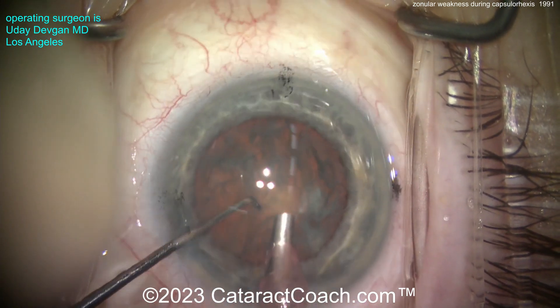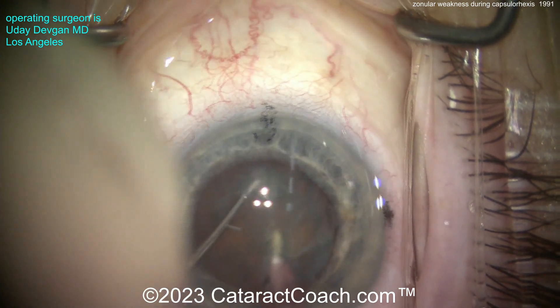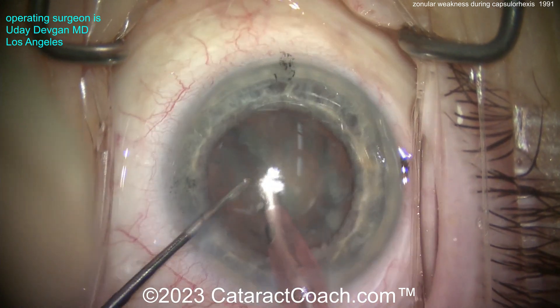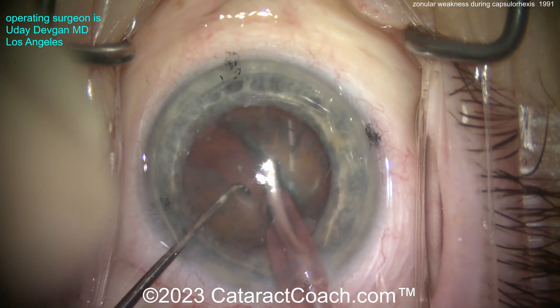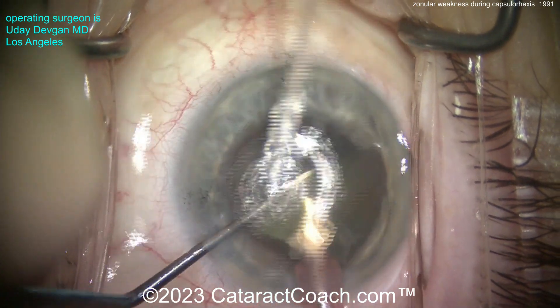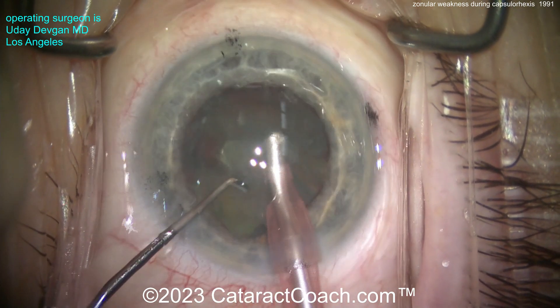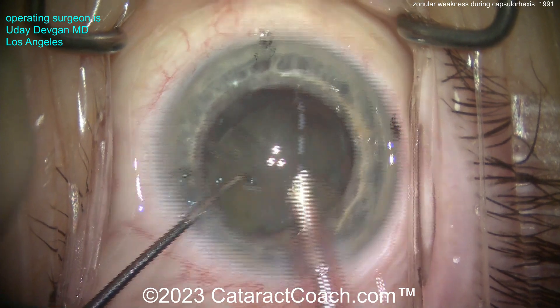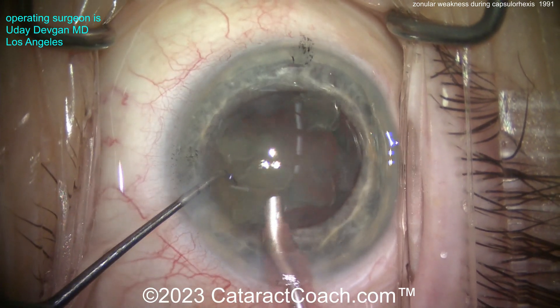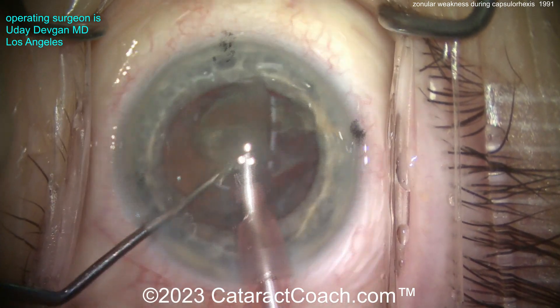For the technique here, let's just do a phaco chop. Buzz in this nucleus, get the chopper in, get that split in half — two halves. Now we can hold one half at bay, bring up the other. Notice how I brought one piece up while the other chopper held the other piece out of the way, to create more of a gap and make it easier to bring the piece up. Now that first piece can be aspirated and wolfed down pretty quickly. It's not that dense of a nucleus, despite the patient's advanced age.